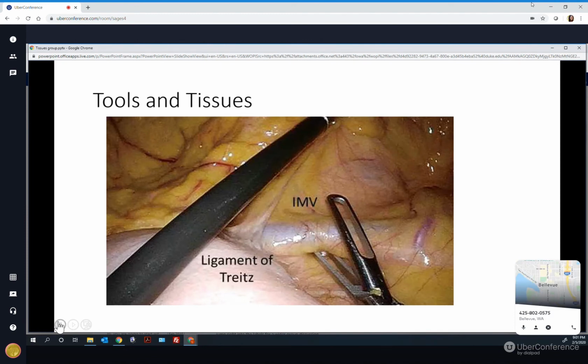I also think it would be really helpful to tell the model what surgery is being performed, because that is a known piece of information and it is likely to improve the model's ability to understand what's going on. Right, without a doubt, and that's the goal of this as well. That falls within the software group's work, and ideally, in an ideal world, we would load a procedure, saying this surgery is going to happen, a laparoscopic cholecystectomy. Then all the weights go towards that anatomic region, those organs, those specific anatomies, and build upon that. That's a great point you just made.